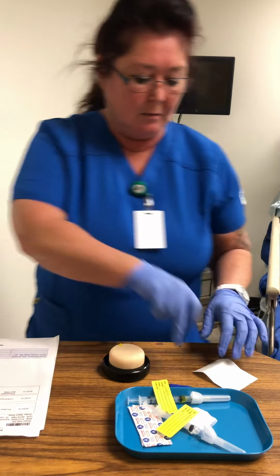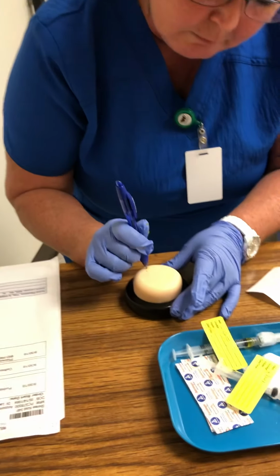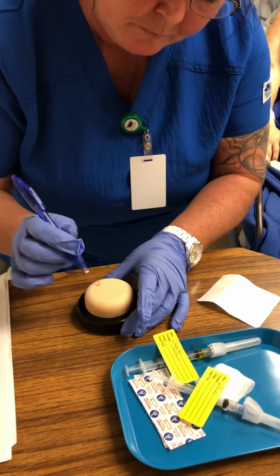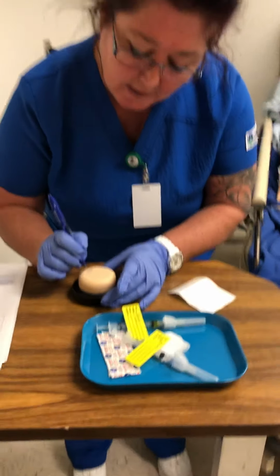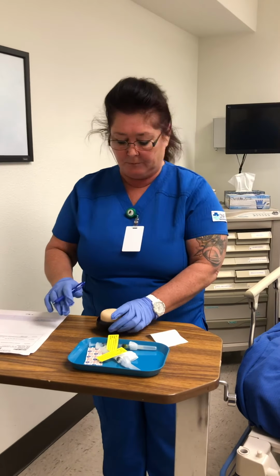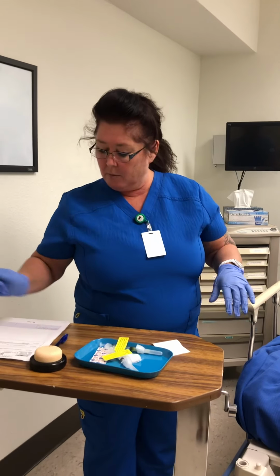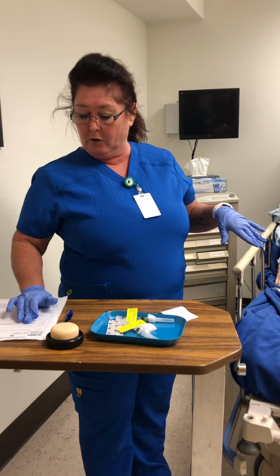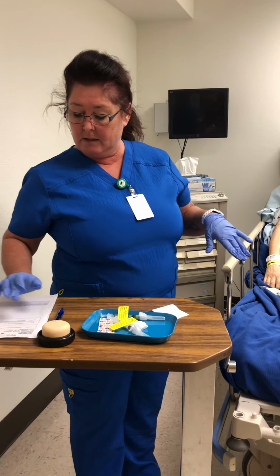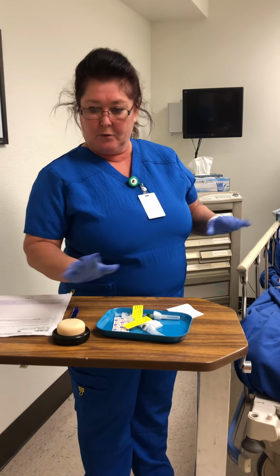So after I've done that, I would take my pen and I am going to draw a circle around it. I would put my initials, I would put the date and the time so that when the next nurse comes in, they can see when it's been done. Okay, and I would administer next the ceftriaxone, but we did that just for video purposes.